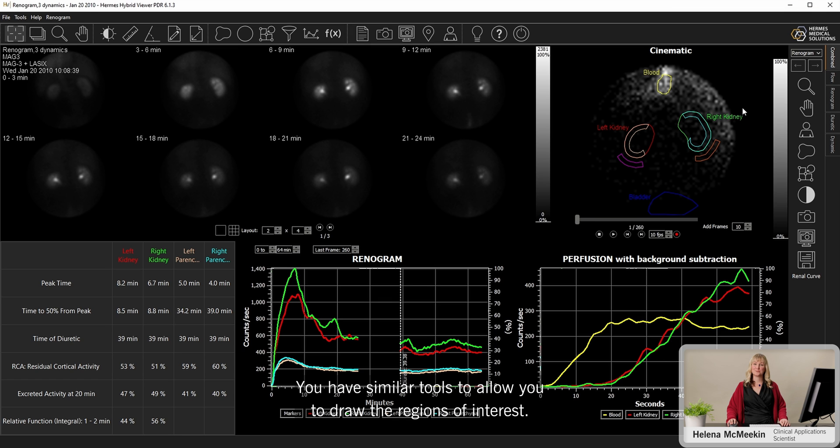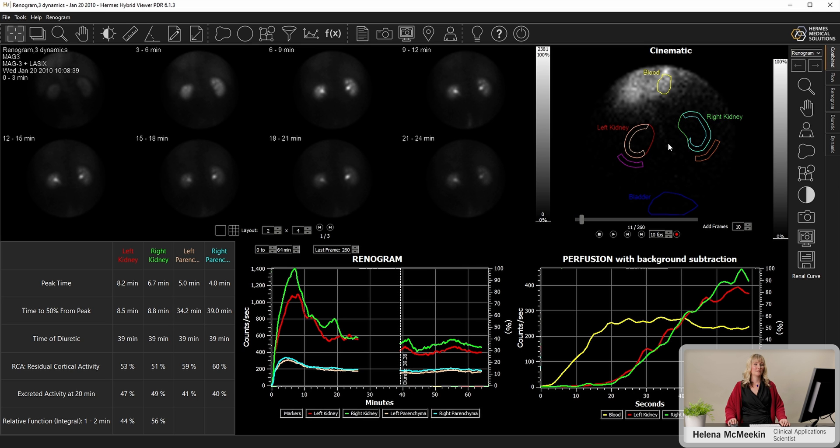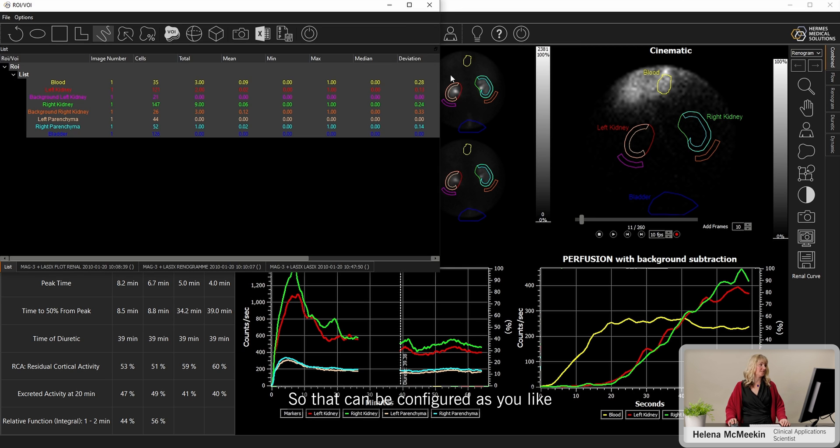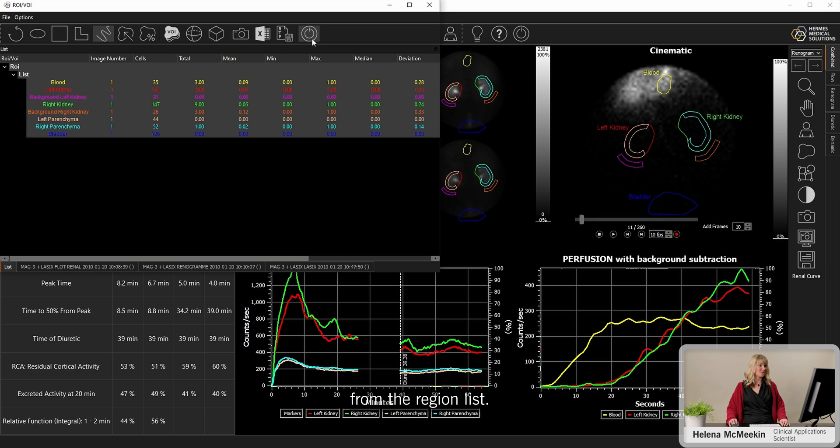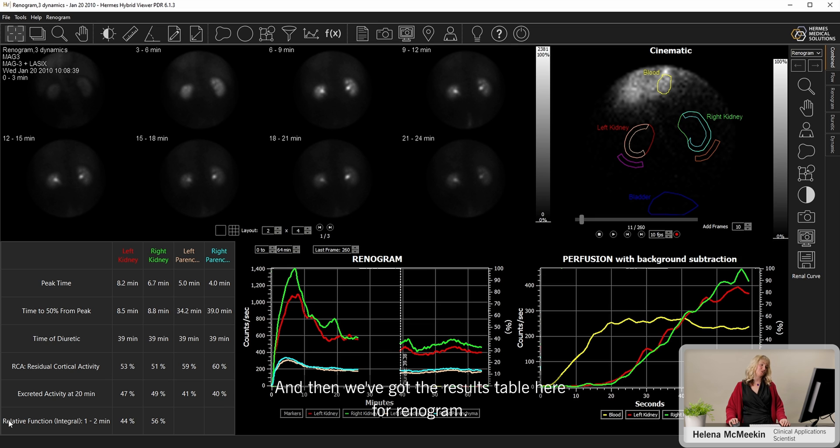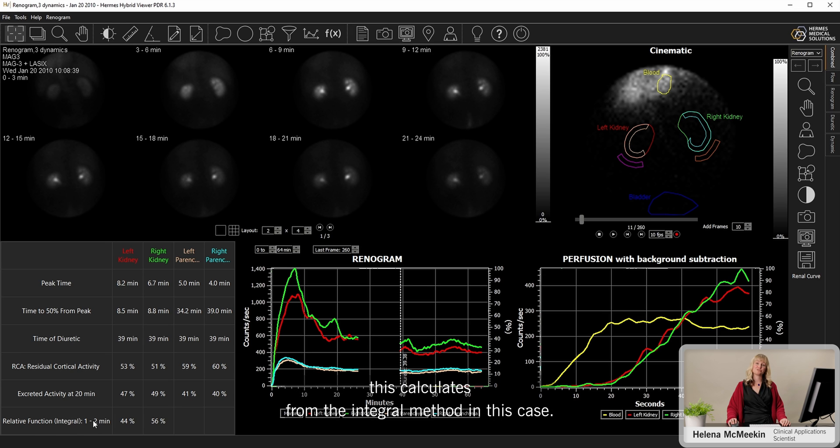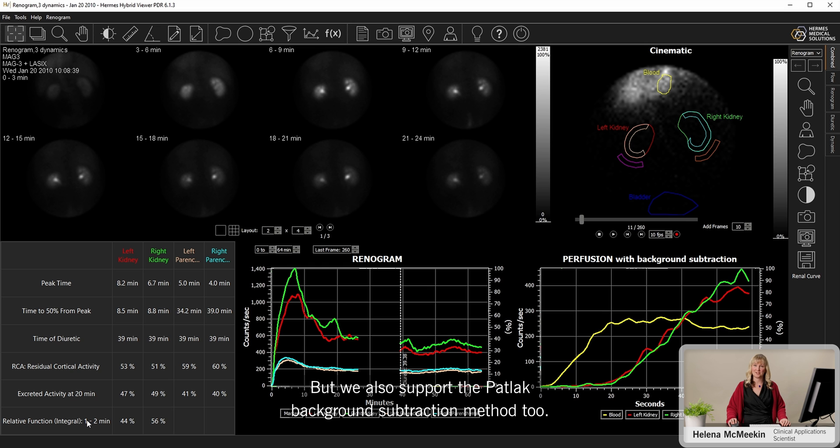And the software is able to display those two portions on the same graph to make the reporting much easier. You have similar tools to allow you to draw the regions of interest. This time we have a blood region and a bladder region too. So that can be configured as you like from the region list. And then we've got the results table here for renogram. So we have the relative function, calculated from the integral method in this case, but we also support the PATLAC background subtraction method too.